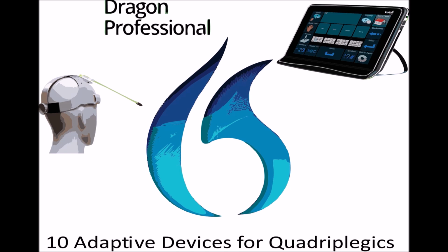ECUs can be controlled using various input methods, such as voice commands, switches, or other assistive technologies such as a joystick or a touchscreen. They can also be programmed to perform certain actions automatically, such as turning off lights at a certain time or adjusting the thermostat based on the temperature.